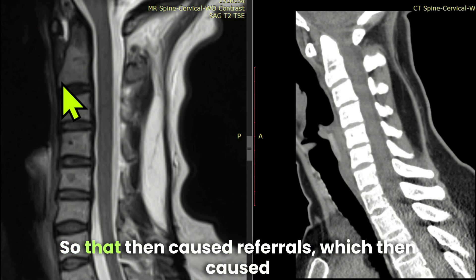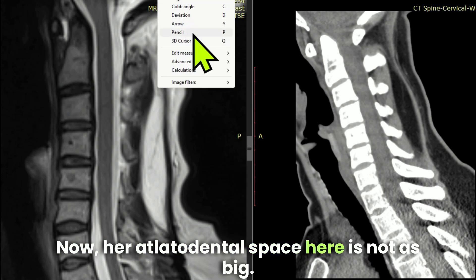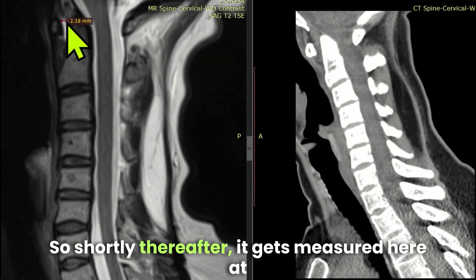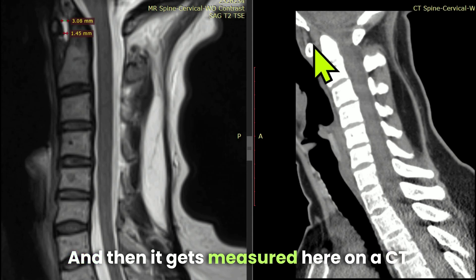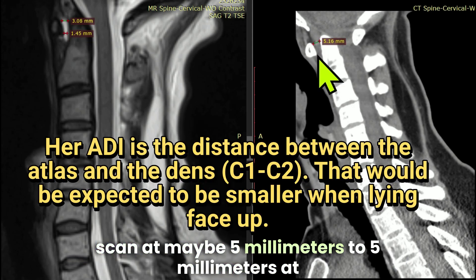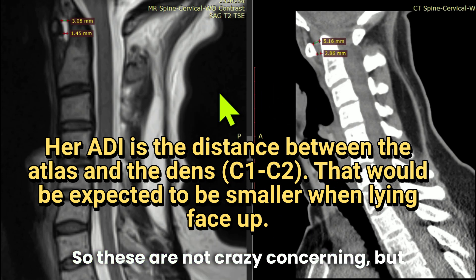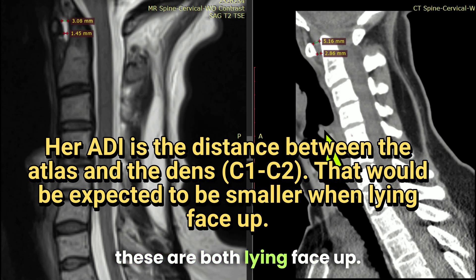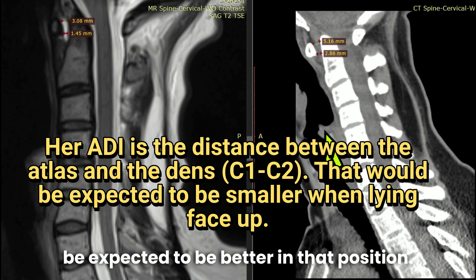That caused referrals, which led to these two images. Her atlantodental interspace here is not as big — shortly thereafter it gets measured at a couple millimeters and is filled with fluid, then measured on a CT scan at maybe five millimeters at the top and three millimeters at the bottom. These are not crazy concerning, but both images are taken lying face up, so her ADI would be expected to be better in that position.